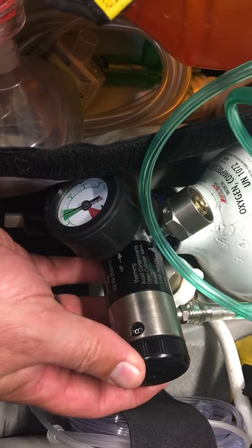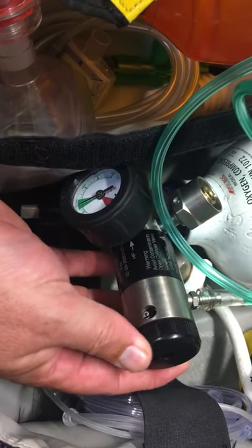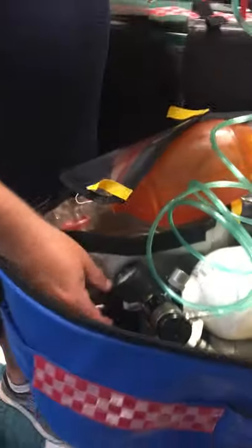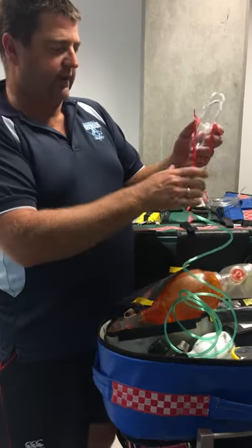8 liters a minute gives you 50% oxygen, or 15 liters per minute gives you 65% oxygen. Just turn that little number and that goes over your patient's face.